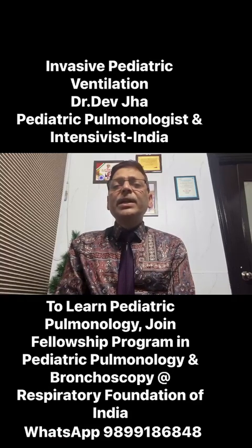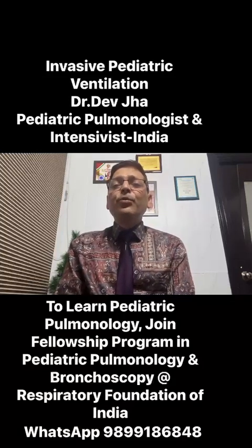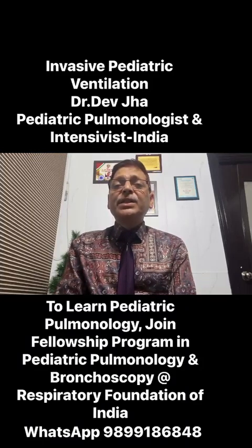So ventilator is not the cure of the disease, it is just a support system. While we are maintaining the oxygenation, that is PaO2, and ventilation, that is PCO2, while we are maintaining these two parameters basically, and pH, we are treating simultaneously the disease conditions.